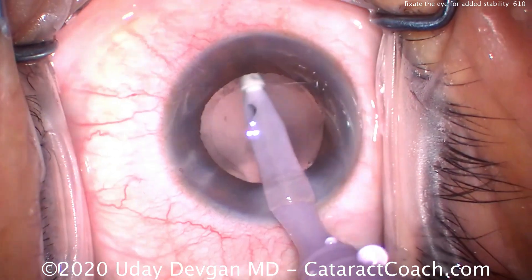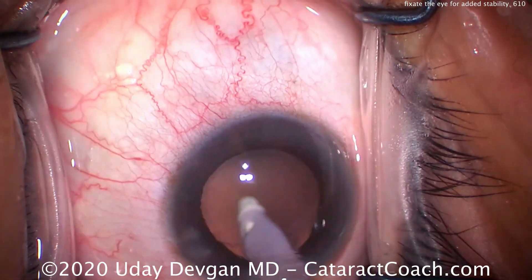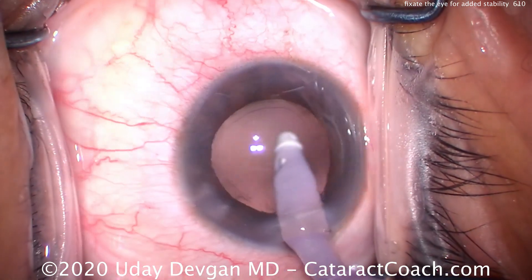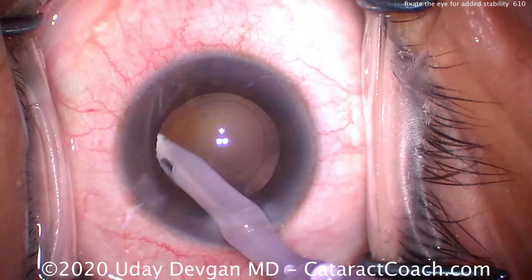We'll polish up the capsule — that looks pretty good. Now, in a case like this where the patient has a higher risk of moving around and higher risk of potential complications, you just do a limited amount of capsule polishing. No need to go crazy over this.